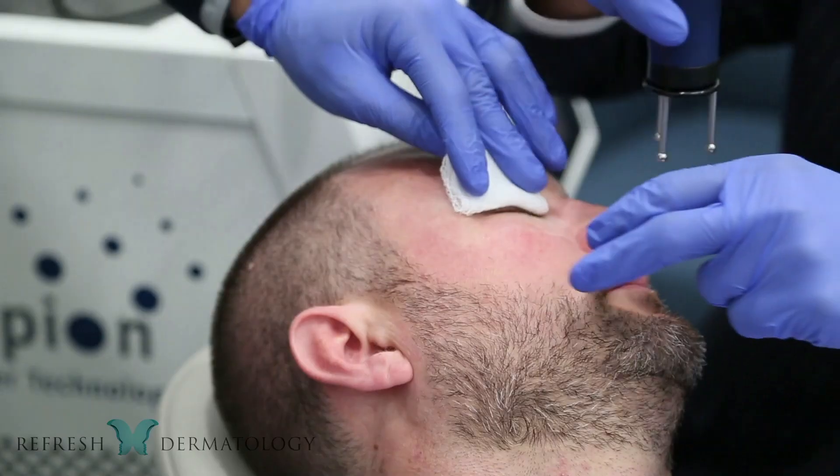The MCL31 Dermablade is an Erbium YAG laser that we use for all types of treatments — skin resurfacing, under eye treatments, scar resurfacing — really a broad range of treatments that we can do with this Erbium YAG.